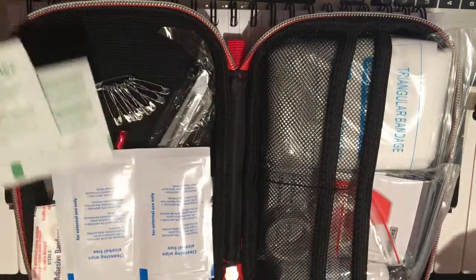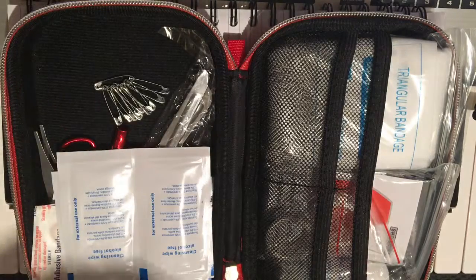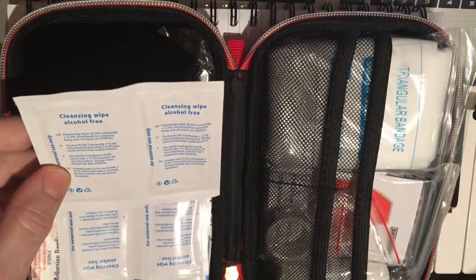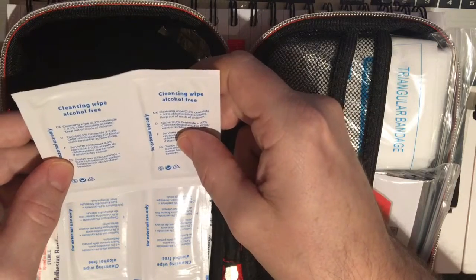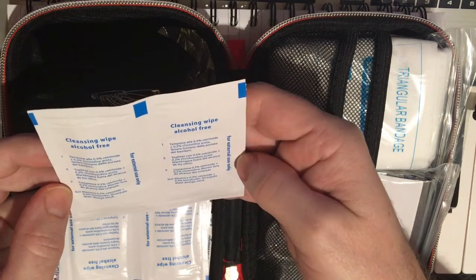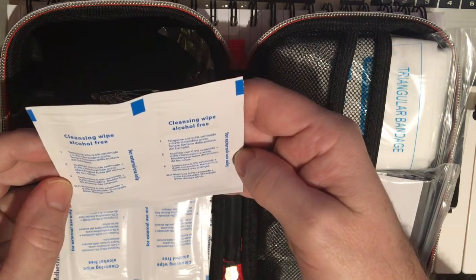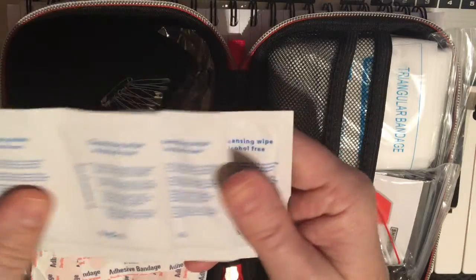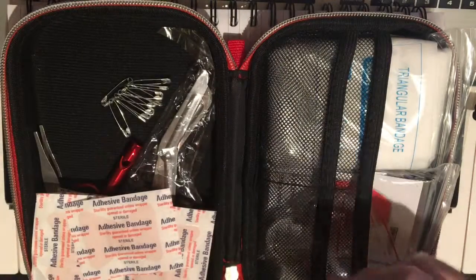We have alcohol-free cleansing wipes — a different chemical makeup, and I assume it's one that won't sting. These may be from the UK but they're probably also from China. Again, at this price point — $18 for this much stuff in the case — it's probably all Chinese.